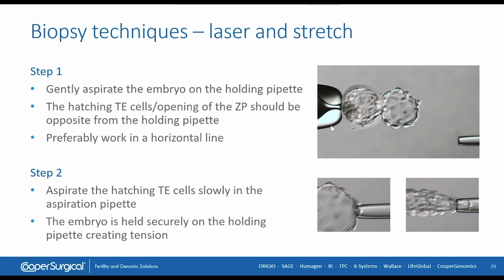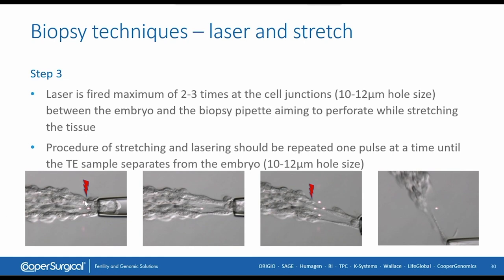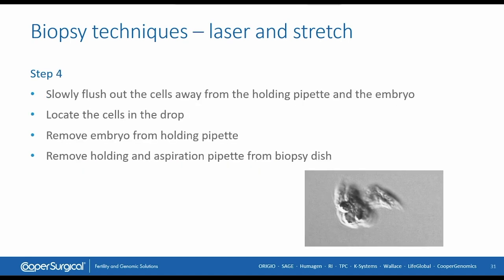For the laser and stretch technique: clamp the embryo at the holding pipette on the side of the inner cell mass, try to have a horizontal line. Approach with the biopsy pipette to the hatching cells and start aspirating. By the pulling and stretching, there may be damage to a cell connection and the blastocystic cavity of the hatching cells may collapse — that is no problem, it is totally normal. Then hit on those cell junctions with the laser, maximum three times, and continue to stretch and pull until the cell junctions break and you have obtained your trophectoderm sample.